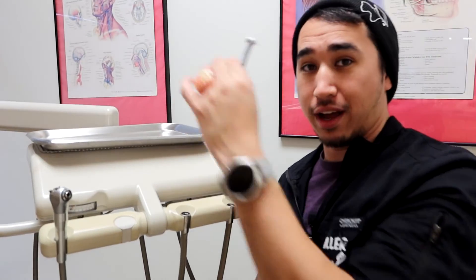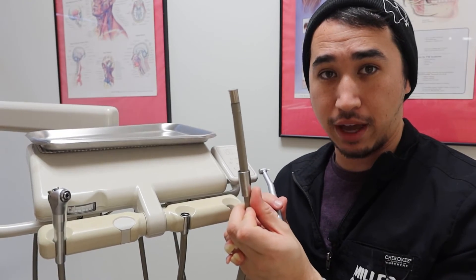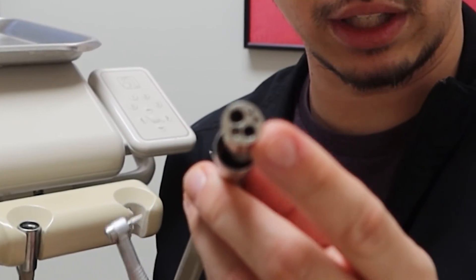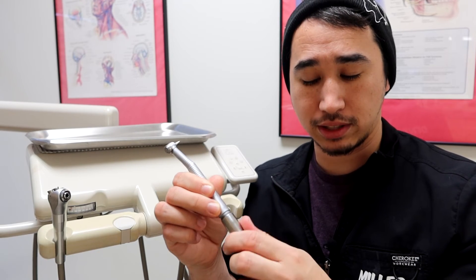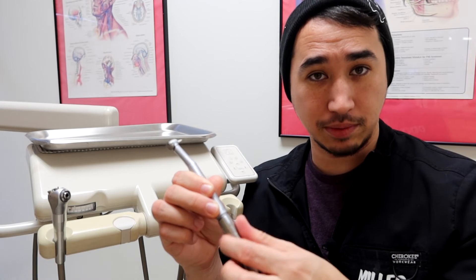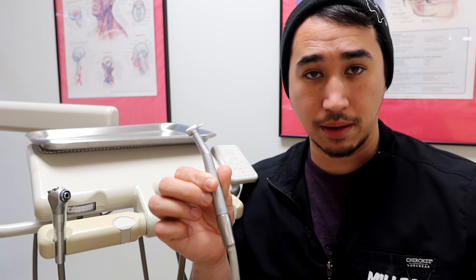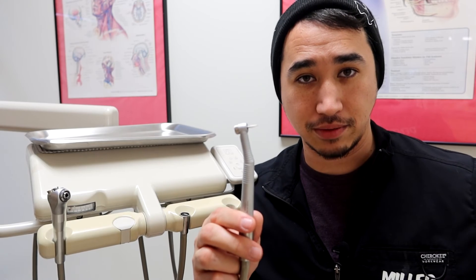When it comes to connecting handpieces, you may have two available hoses — one specifically for high speed and one for low speed. Take your high speed handpiece, find the hose with the matching porthole configuration, mesh them together, pull up the collar, and twist. It should be easy to twist with simple finger pressure until you hit a bind where it's fully connected. Then hit your rheostat and give it a spin.